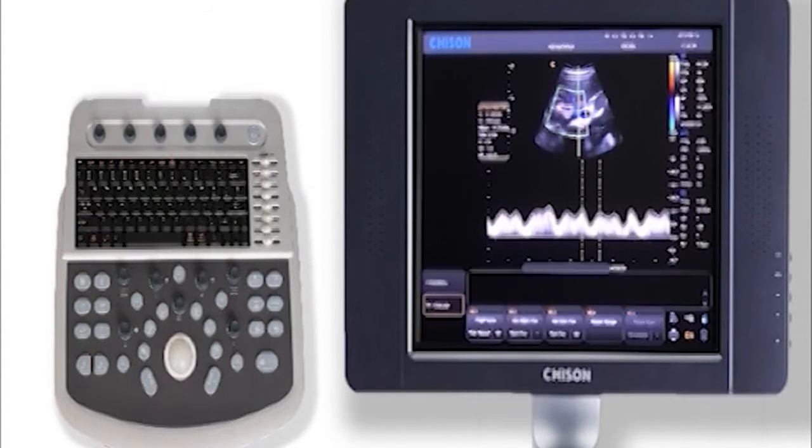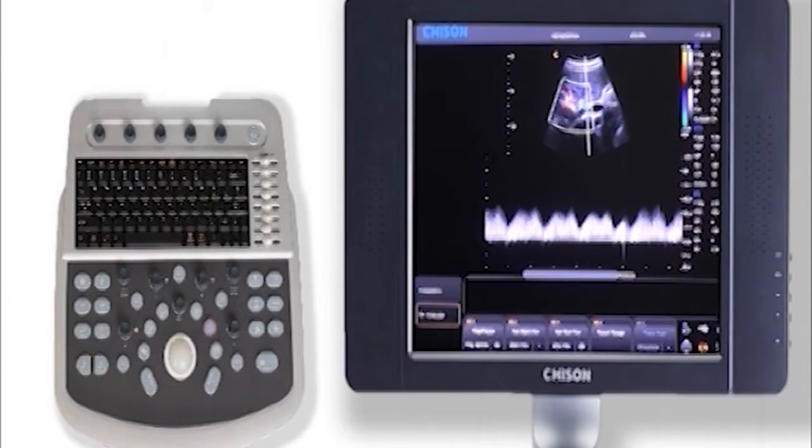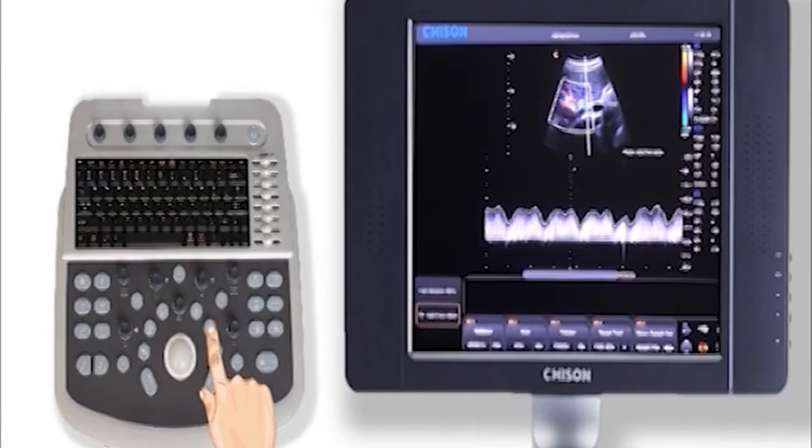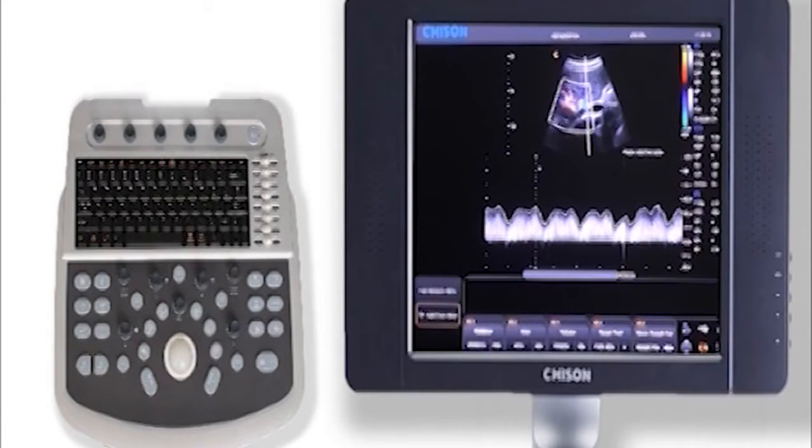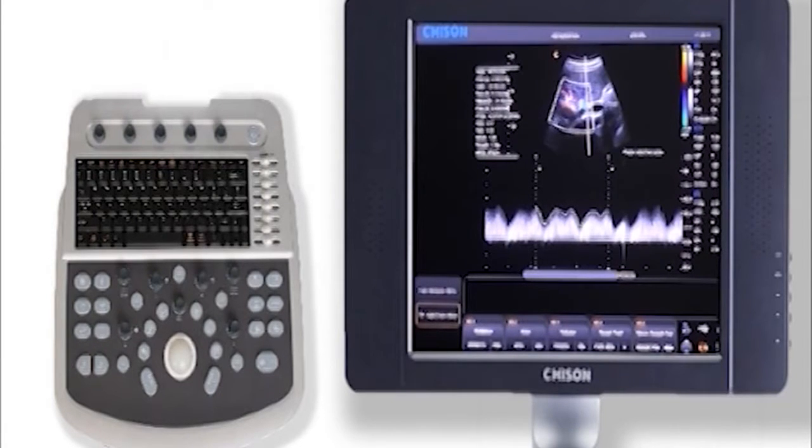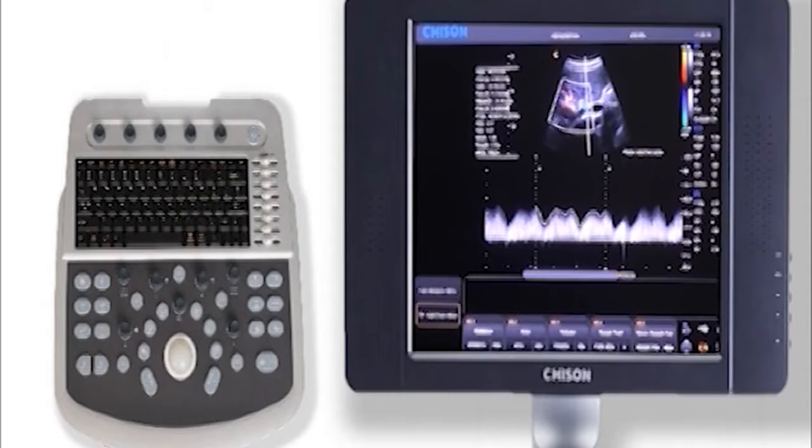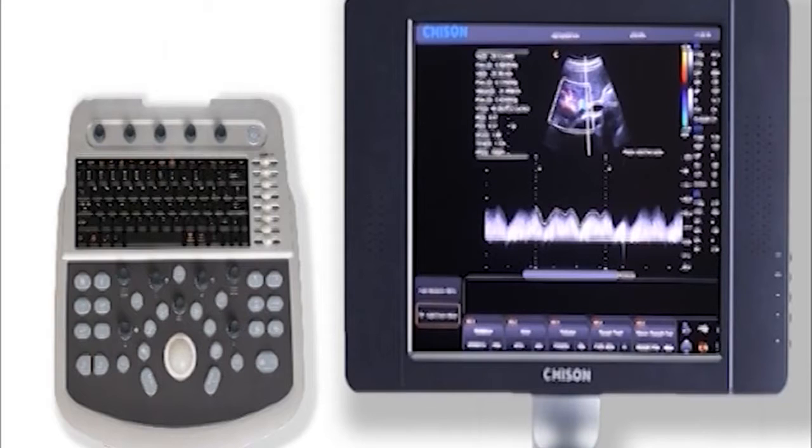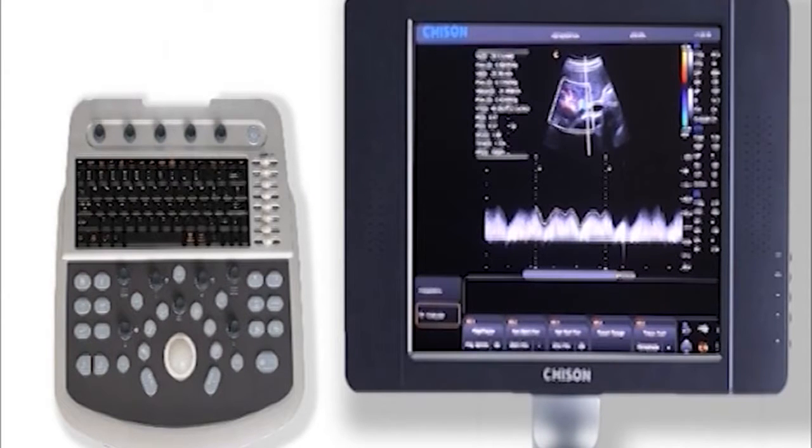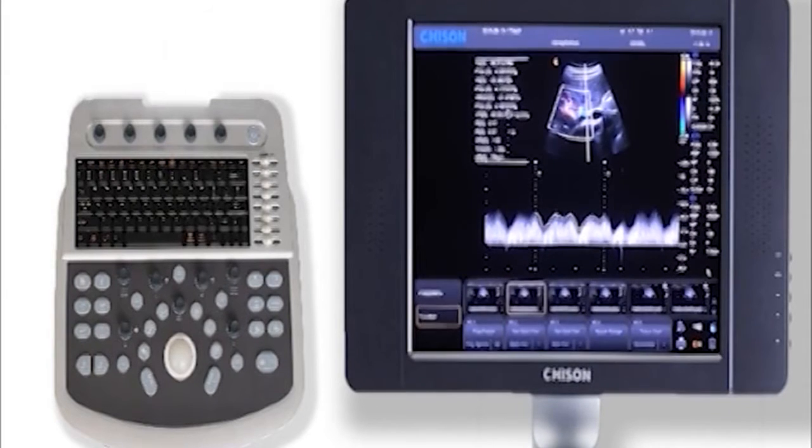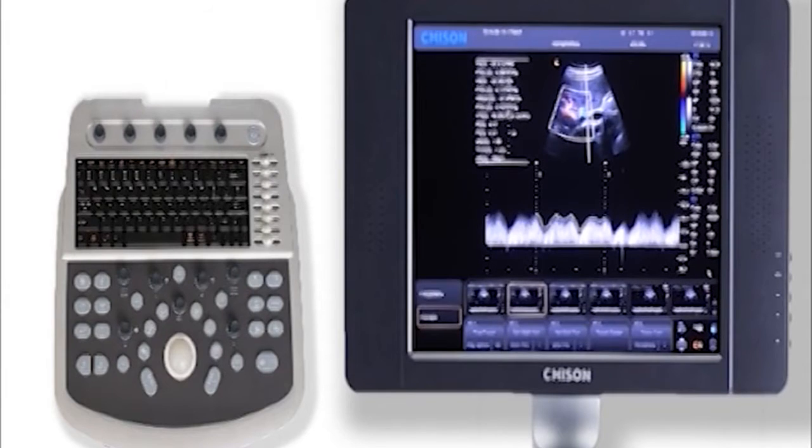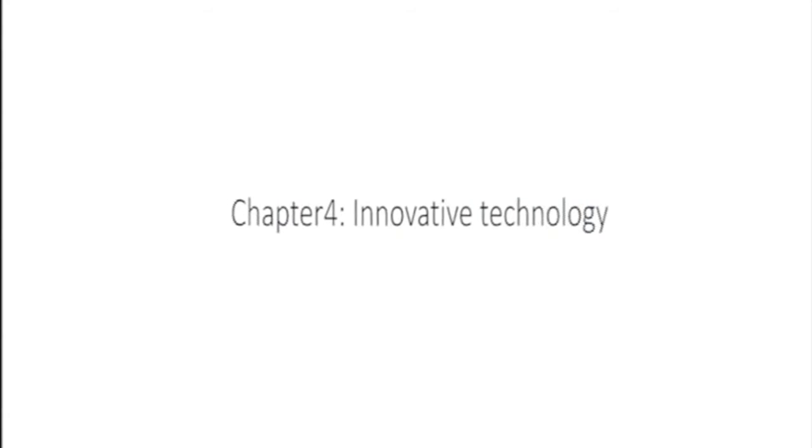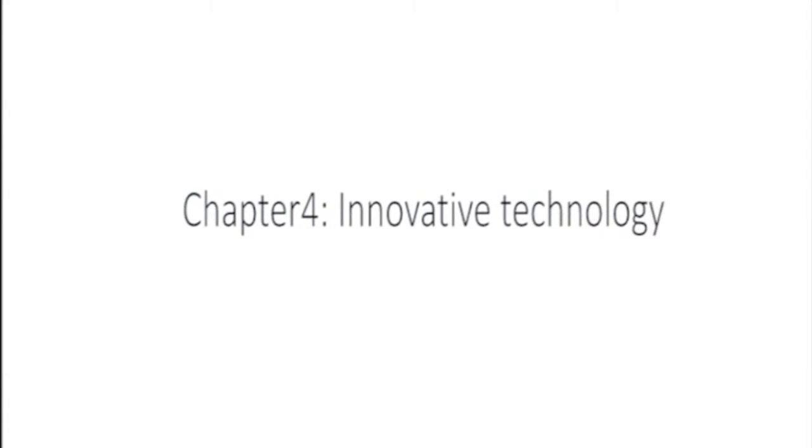After we finish the color and Doppler scanning, let's do measurement. Press this key to trace Doppler automatically and give you a lot of results. Also, there is a calculation package for Doppler measurements. Press it, you can find many items here.